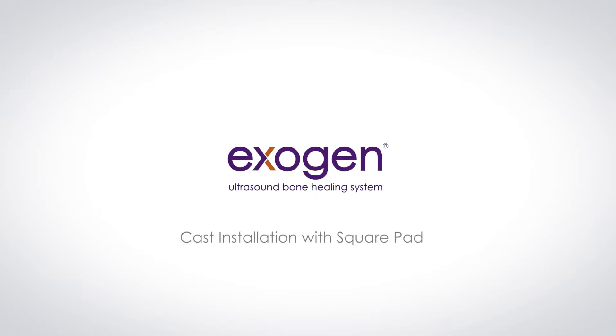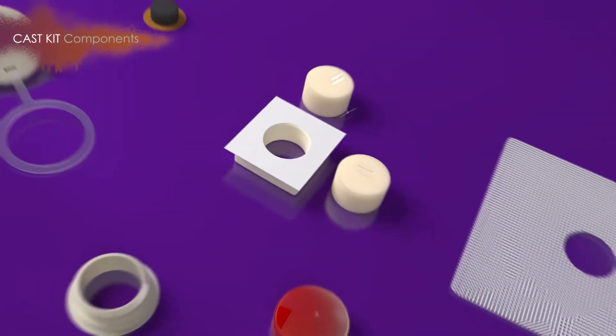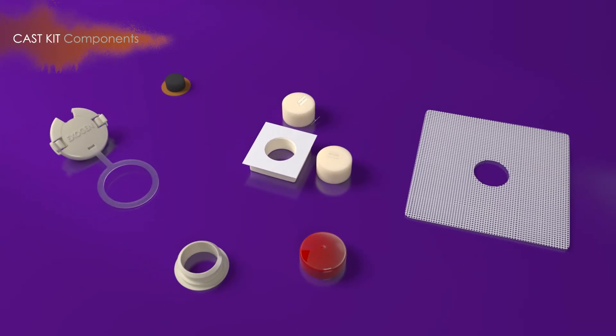This video is an overview of the CAST installation with a square pad for the Exogen Ultrasound Bone Healing System. Before you begin, let's review the components of the CAST kit.